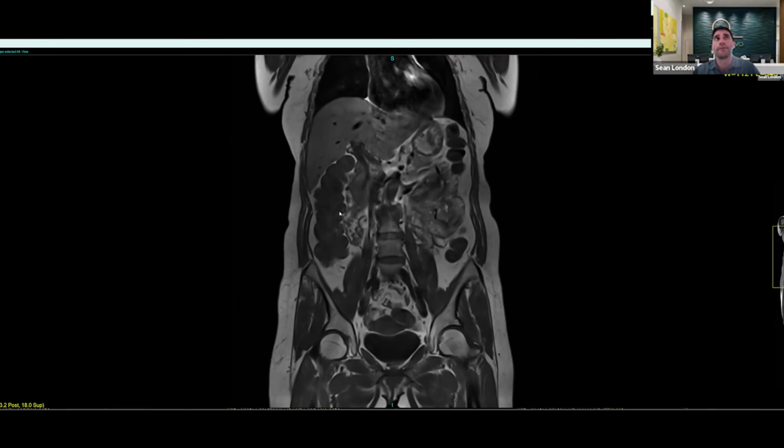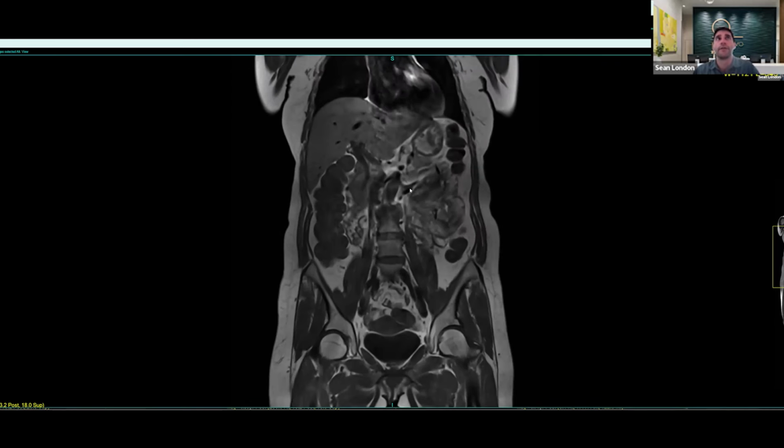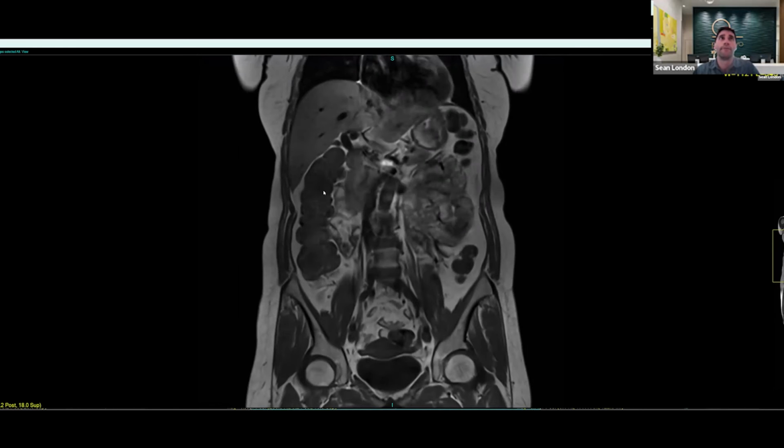If there are any polyps, they remove them then, and then they look under the microscope to see if there are any kind of pre-malignant or just benign polyps, and go from there. There are other non-invasive tests that are out there that can be explored as well, but colonoscopy is certainly the gold standard for colon screening right now. But I still do take a look to make sure that there's nothing concerning. And what I'm looking for are any kind of constricting masses, wall thickening, or signs of inflammation, and I don't see any of that here.